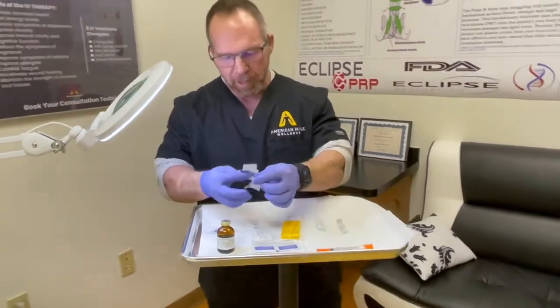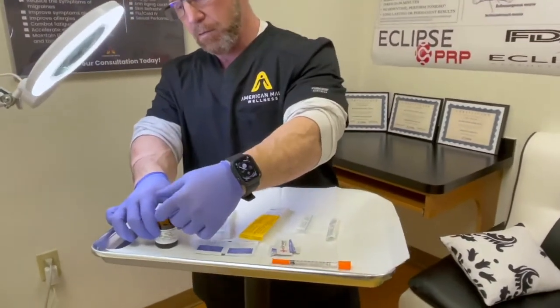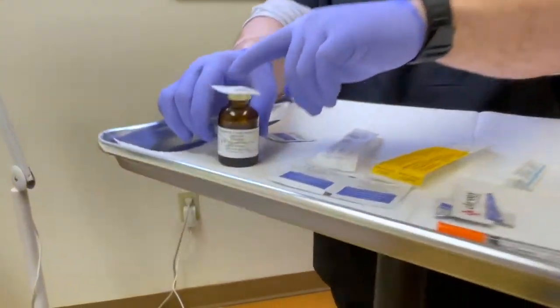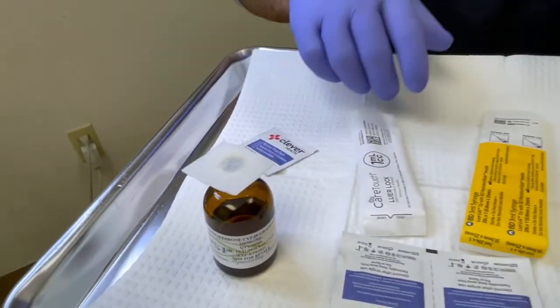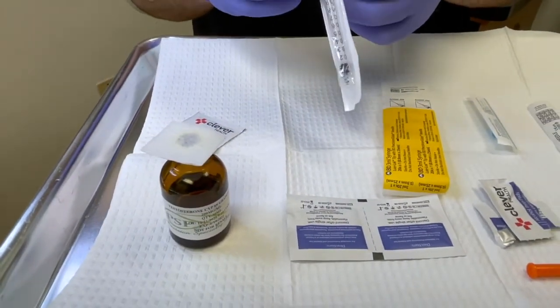To get started, the first thing I want to do is make sure everything is clean using good aseptic technique. I clean with an alcohol pad and leave it on there for a length of time to kill any bacteria.